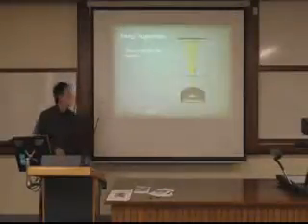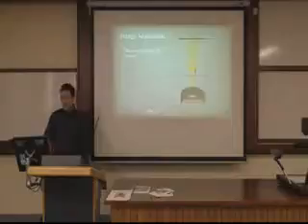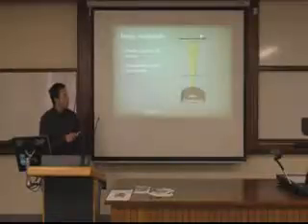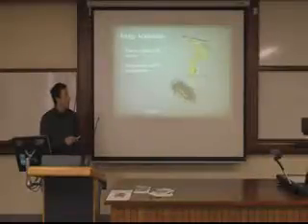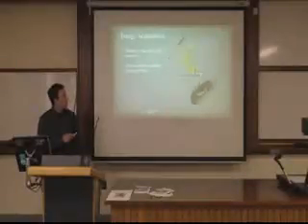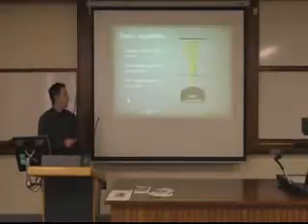And so for image acquisition, the phantom is placed in the isocenter. The gantry is brought down to negative 179 degrees, where 0 is top dead centre. And the gantry rotates about as the EPID, this flat panel here represents the EPID, that captures images at a frame rate of 7.5 frames per second.